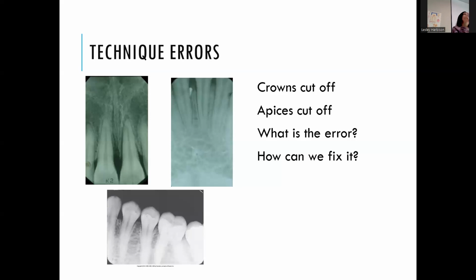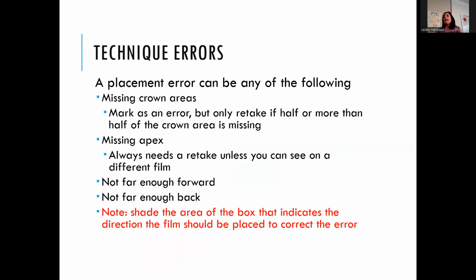Some of the instructors hate those stickies, so it's literally a last resort, but sometimes you have to use them because they're smaller and the patient just can't tolerate the XCPs that we have. But this is usually what happens when you use the sticky ones for the posterior or the anterior PAs.